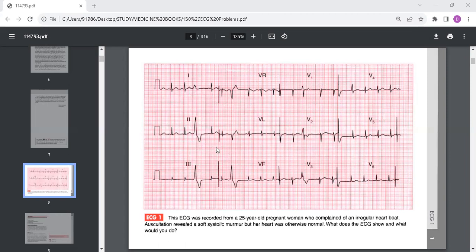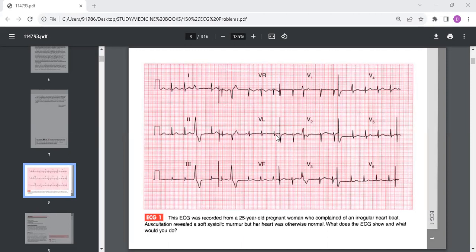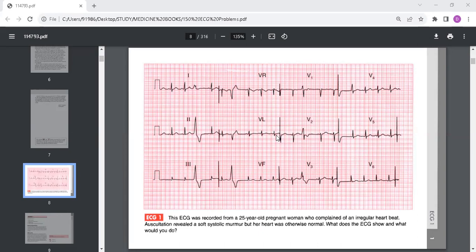Ventricular extrasystoles are very common in young females. There is a correlation between the presence of extrasystoles and heart disease of many types. However, in young people who are otherwise asymptomatic and those whose hearts are otherwise normal, the chance of significant cardiac problems is very low. Occasional extrasystoles in this context do not require investigation. With more frequent extrasystoles, an echocardiogram to confirm a structurally normal heart provides additional reassurance, and specific treatment is not usually required beyond avoidance of alcohol and caffeine. This is a classical ECG of sinus rhythm with ventricular extrasystoles.